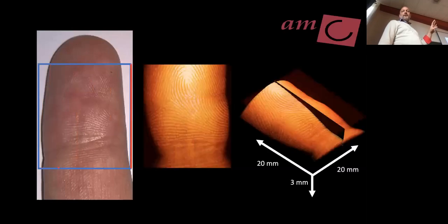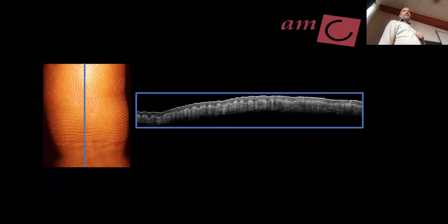Again, OCT of the skin, beautiful. We can do this fingerprint, awesome stuff. All the layers of, for example, your fingerprint. This is something that's being used in research now for fingerprint detection, because you have the same fingerprint in the deeper layers of the skin. So you have people that try to remove the fingerprints by sanding it down or using a chemical, yet that fingerprint is also present in deep layers. And we have people in our group that study that.